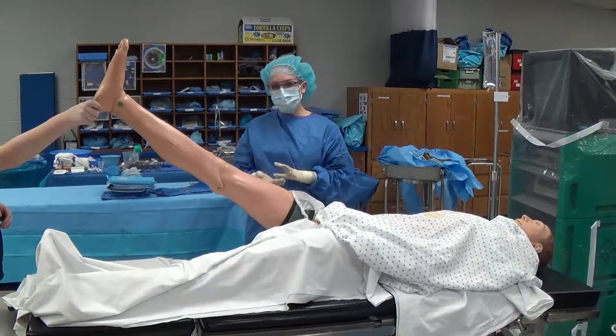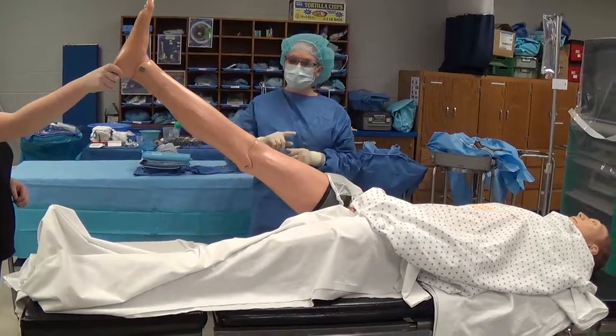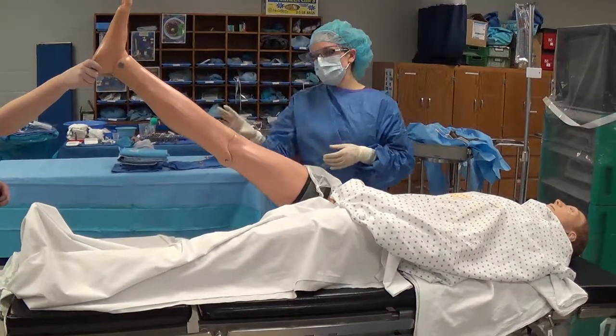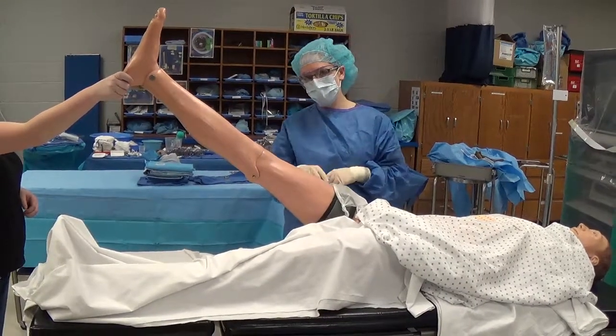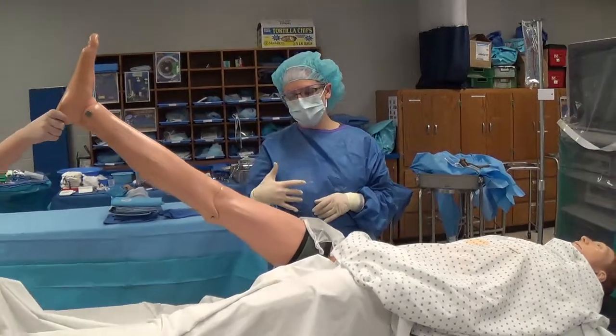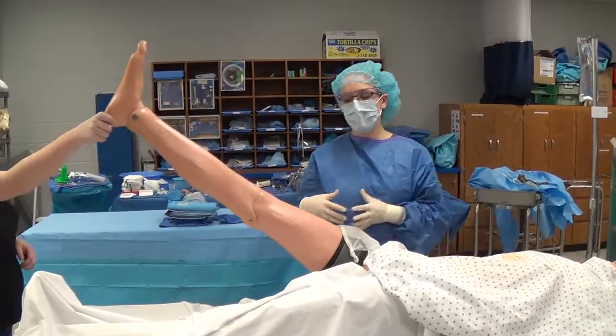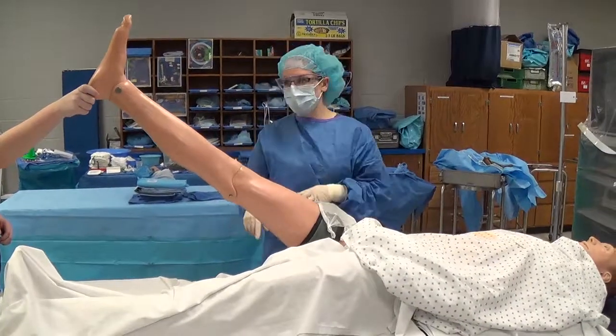This is going to be lower extremity draping, showing you the various sheets that go on for that type of draping sequence. Remember that a lot of times on extremities we utilize a tourniquet, so we will have usually an unsterile sterile drape placed by the circulating nurse around the tourniquet, which prevents the prep solution from getting underneath the tourniquet. Our draping will go basically up to where the tourniquet is placed.